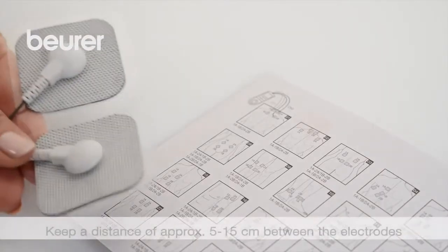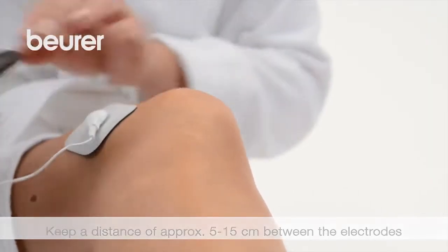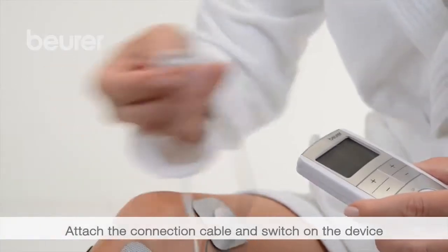Please ensure that a distance of 5 to 15 cm between the electrodes is maintained. Connect the connection cable with the device and switch it on.